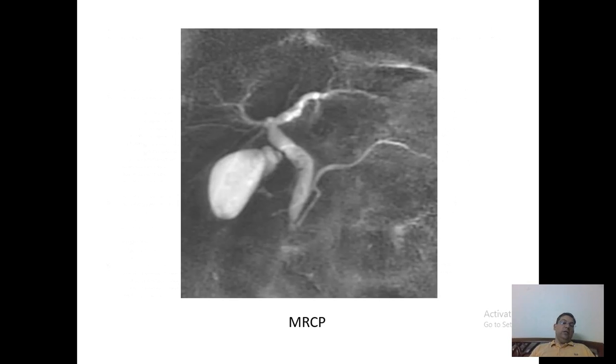The benefits of MR, as we know, are that there is no ionizing radiation. The patient does not have to undergo any kind of invasion. But of course its limitation once again is that you cannot do any therapeutic work with it.